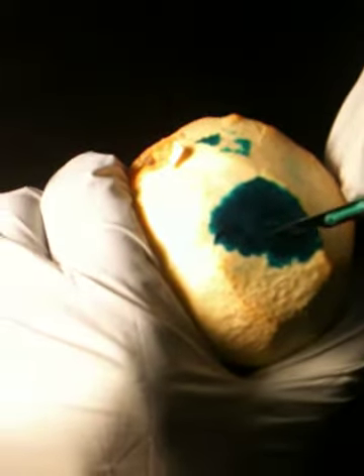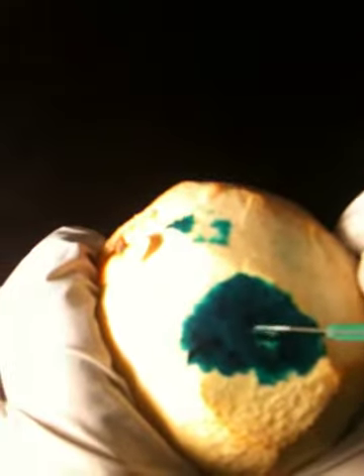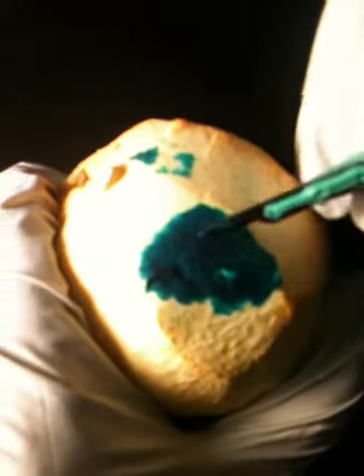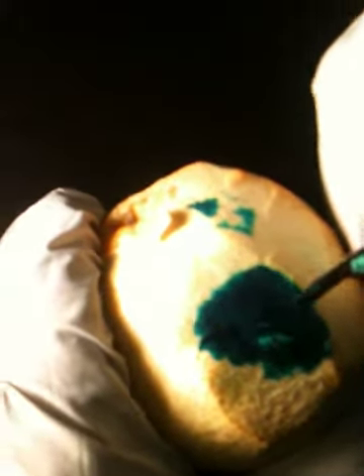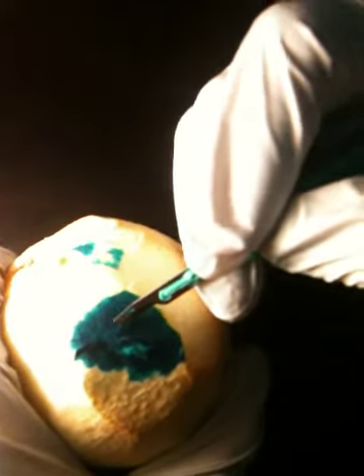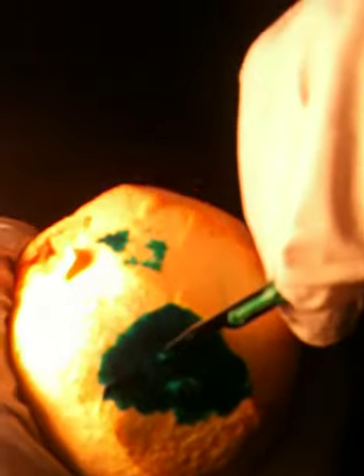You see that the tissue here is a little sky bluish in color rather than just white. So we have not gone deep, or we've not penetrated the granulation tissue. And if you see here, you can see the light bluish tissue, so we are good here. And I'm going to show you one more side where we have not gone deep. You see, this is again granulation tissue. You can see that there's a bluish color, so we have not gone deep here.